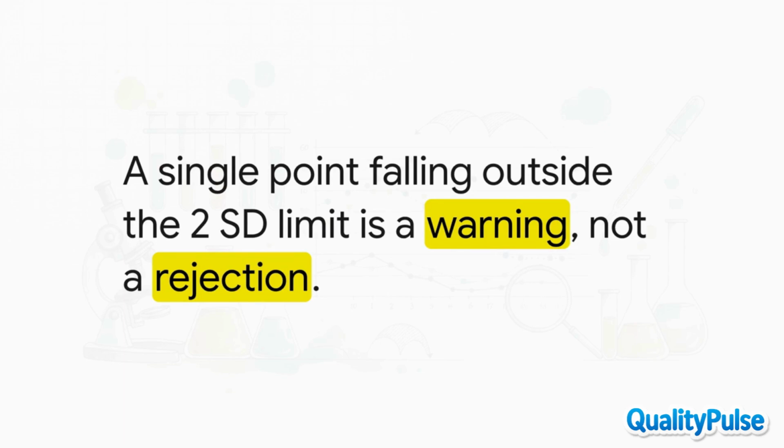The really crucial thing to remember here is that this one is merely a warning. It triggers when a single point falls outside the 2 SD limit. Why is it just a warning? Well, remember earlier, about 4.5% of perfectly valid results naturally land here anyway. So if you see this pattern, your action is to investigate. Look at previous runs, but whatever you do, do not immediately reject the run if there's no clear error.